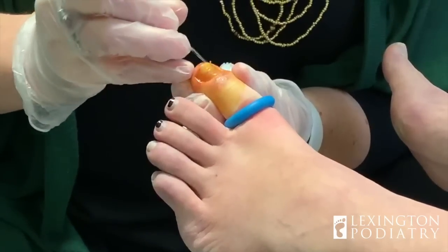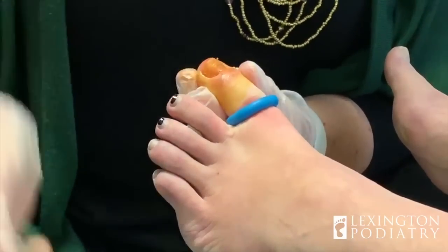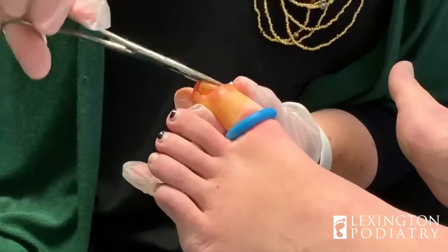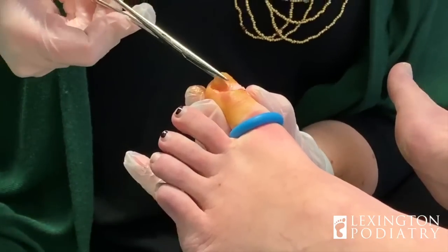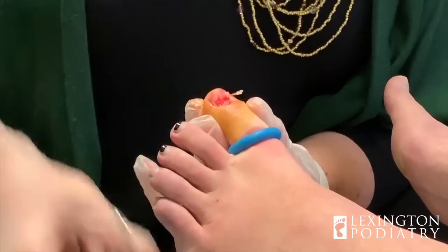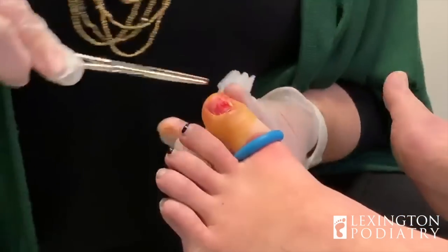Lots and lots of pressure — that's all you'll feel. Two more seconds and it'll be off. Done. Good job. Yes ma'am. I told you.